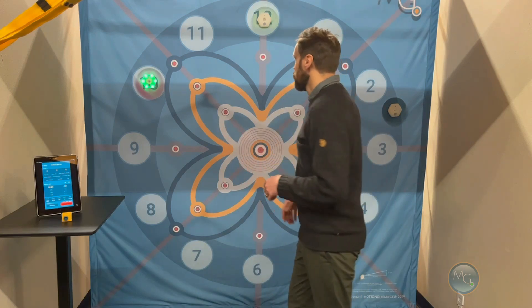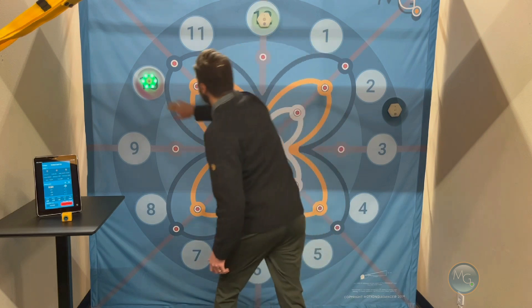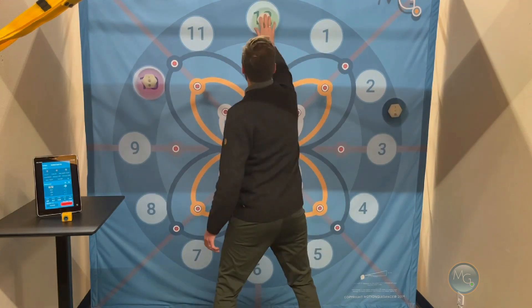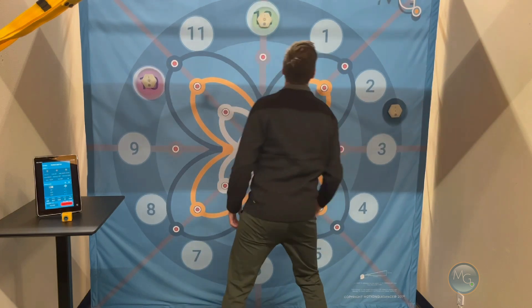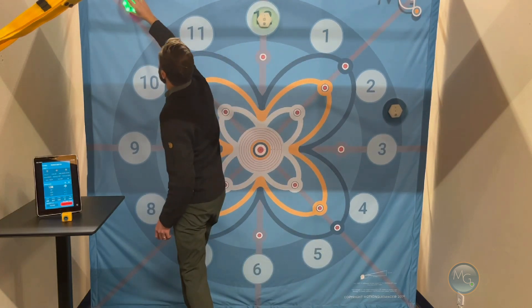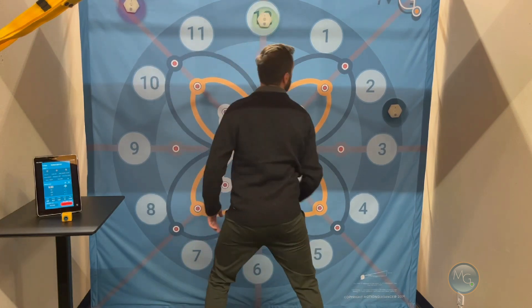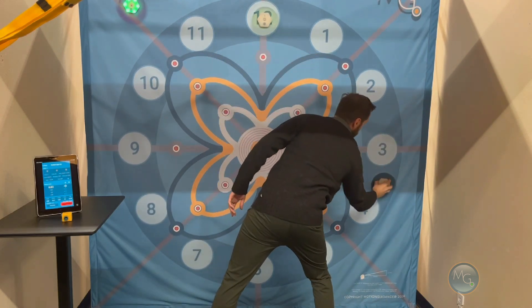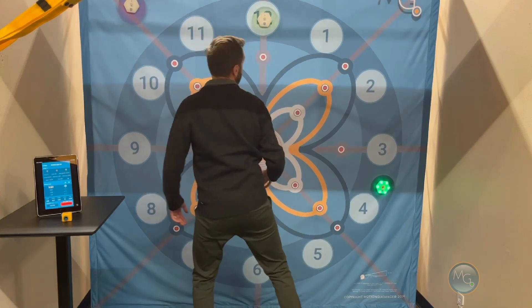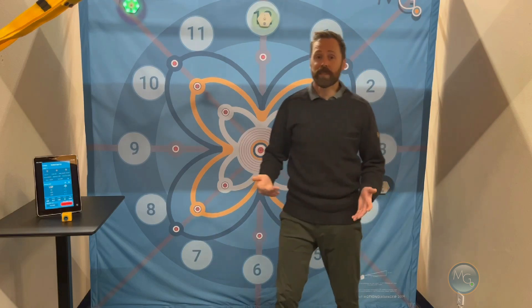So with this larger system, you can move these pods around depending on where you want to promote movement. For instance, I could have someone here doing the touch function — and let's say I want to get a little more reach. I can instruct them to only use their right hand. You can manipulate where you want targets. That's just another nice feature of having this larger system with the movable pods.